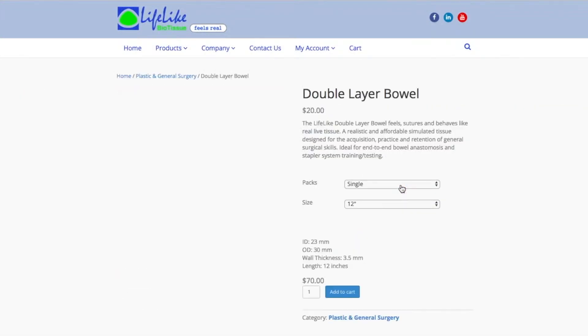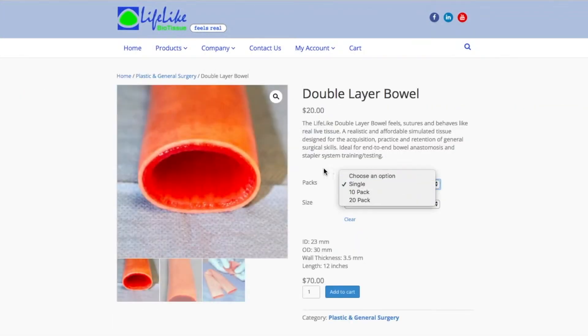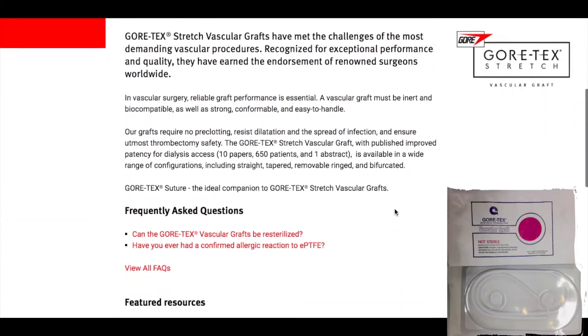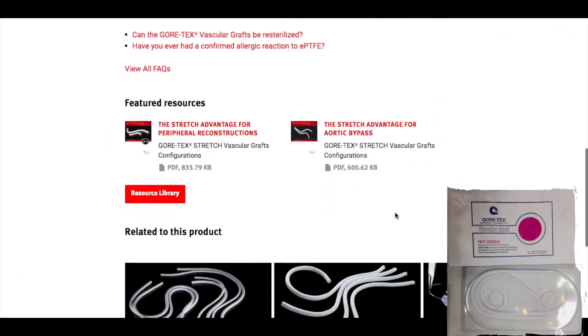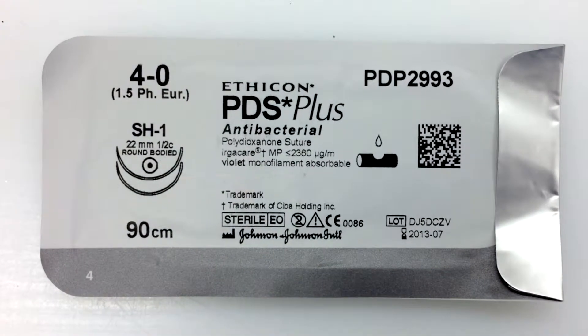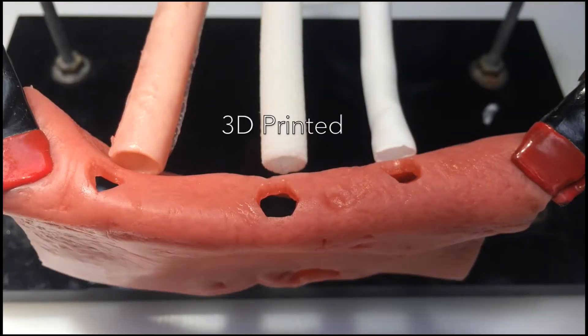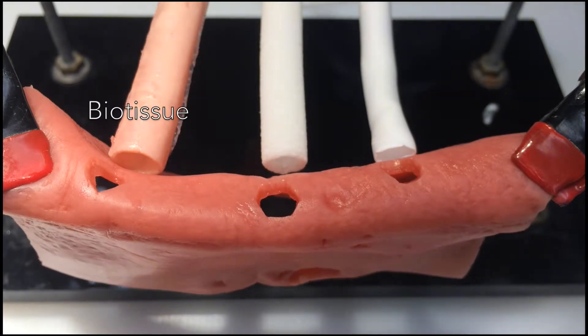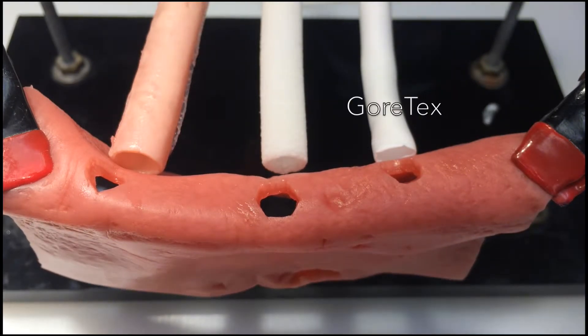I bought the other materials on Lifelike Biotissue and I got a Gore-Tex vascular graft. We will use these materials to compare the anastomosis with a 4-O suture. The middle one is the 3D printed material, the left one is the biotissue material, and the right one is Gore-Tex.